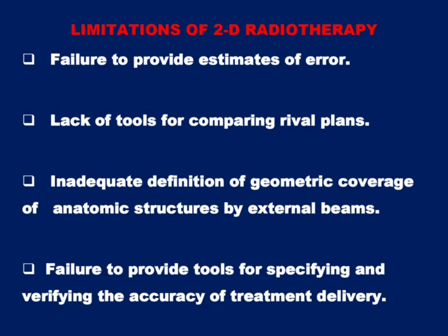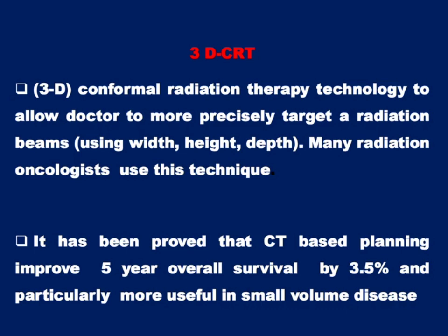Every organ has a tissue tolerance dose, that is TD 5/5 and TD 50/5, and tolerance also depends upon the volume of the tissue you have taken for radiation planning. Like in the lung, one resident must remember all the tissue tolerance doses, so that while planning on the computer you can see that a certain amount of dose should not exceed to that critical organ beyond the TD 5/5. Otherwise there will be serious side effects. So that is what I want to convey to you guys.